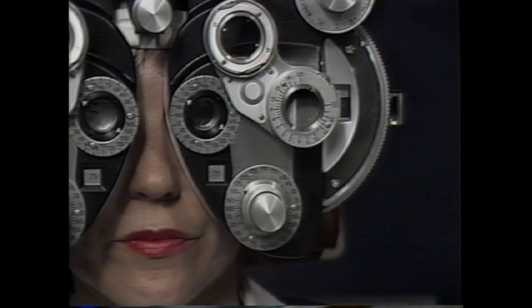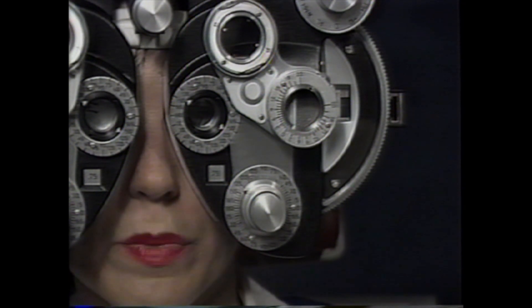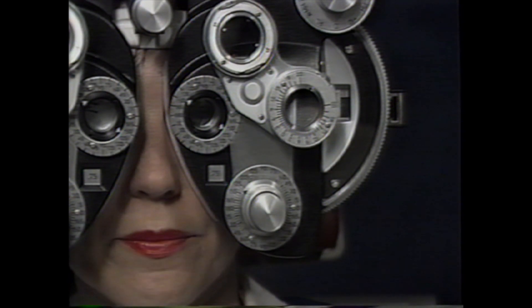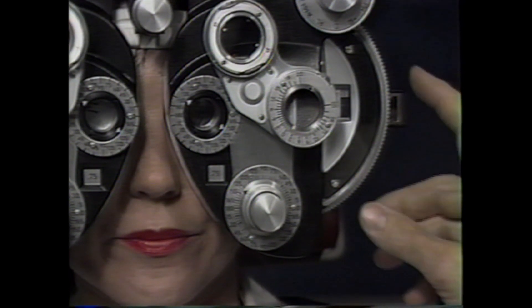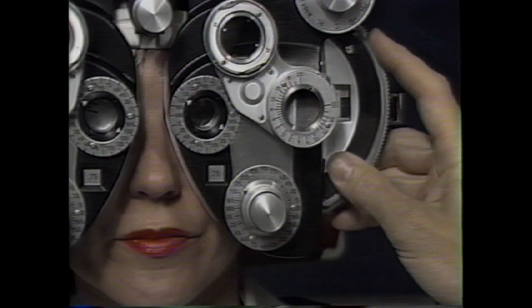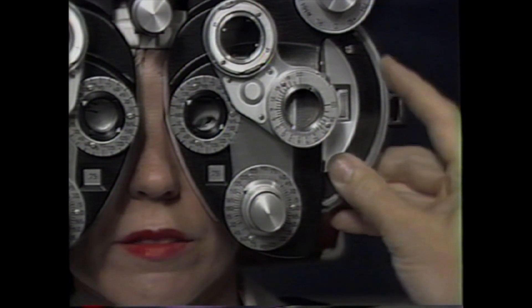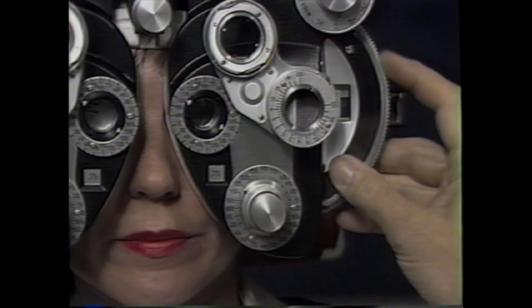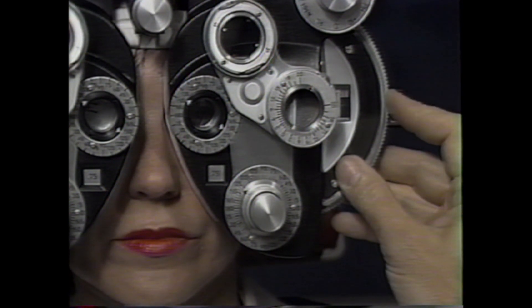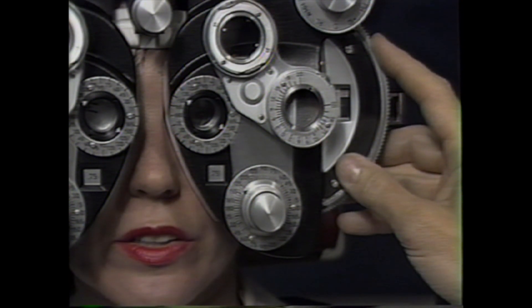How far down on the chart can you read now? O-H-P-N-T-Z. Good. Now, once again, I'm going to change it. Is this better or worse? Ready? There. That's worse. Let's go the other direction. Better or just smaller and darker? Ready? There. Just smaller and darker.